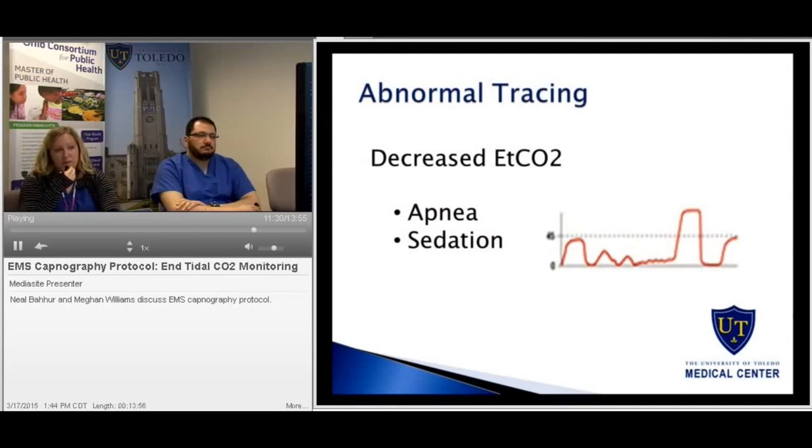You can also see it in procedural sedations, which would be used more in the hospital setting and not the pre-hospital setting. But this can be a sign that your patient is going to have some impending respiratory malfunctions, and you should probably take action pretty quickly.